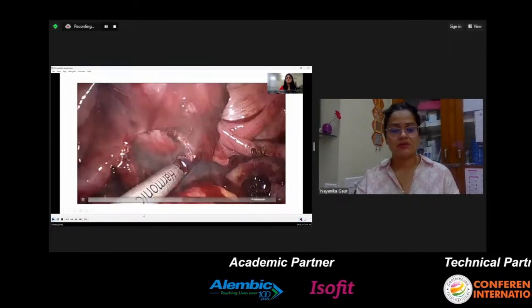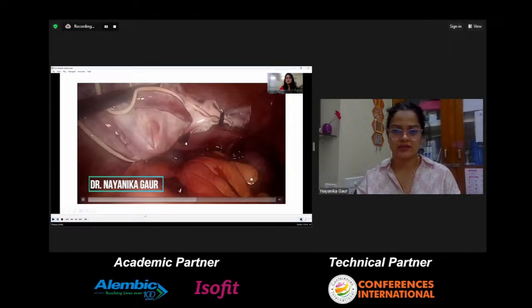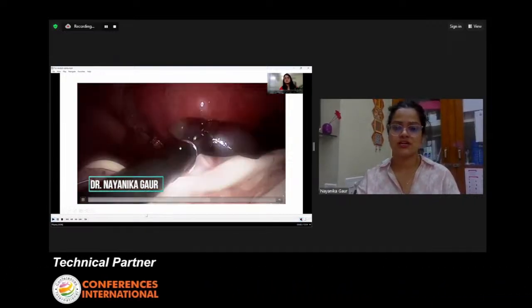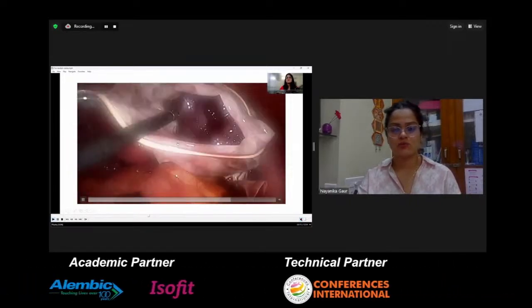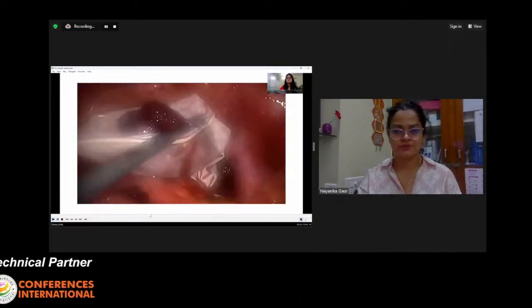And here again, the treatment remains salpingectomy, and this patient had to be posted for IVF in a subsequent cycle for pregnancy later on. The tissue was again removed through an endobag made from a glove, which is a very comfortable way of removing smaller tissues.